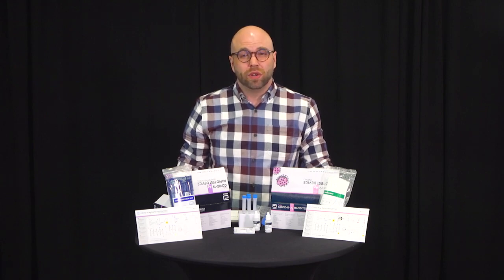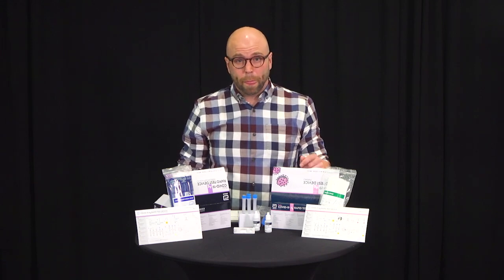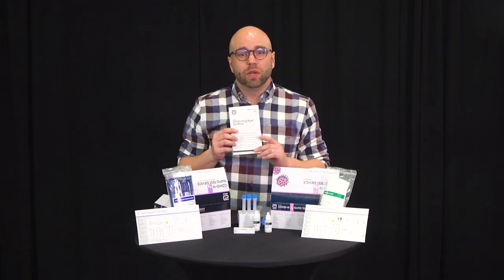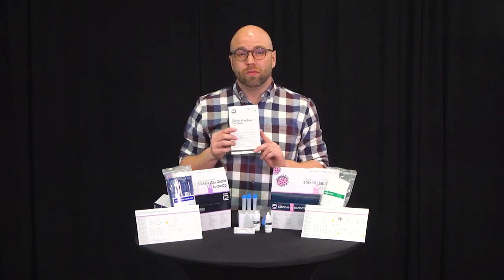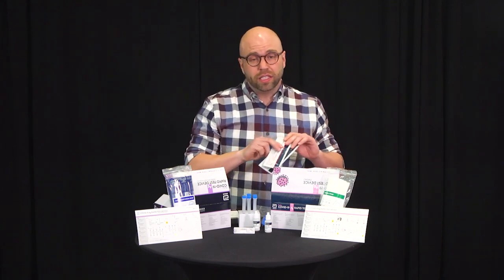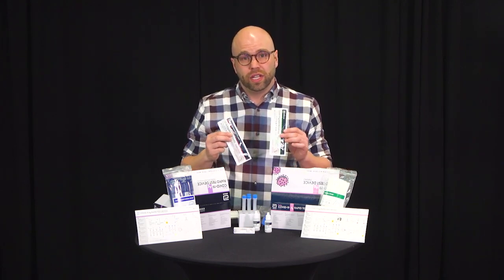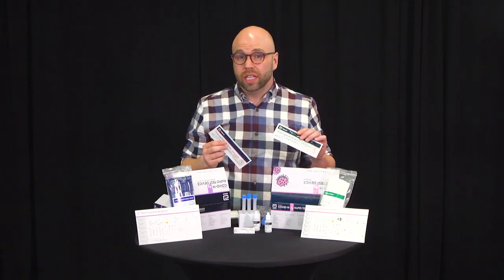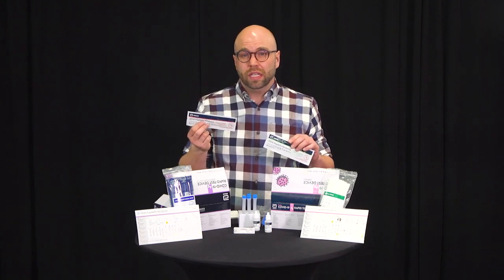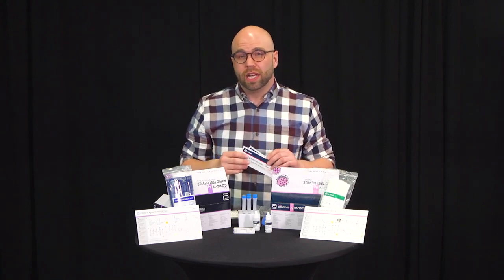The rapid test is a screening tool and not a full PCR test. When you receive your kit of 25, you'll also receive a manual. Please read the manual so that you know exactly what type of test you are performing. You'll also notice that there are two control swabs in the box. These are not to be used for any nasal collection. One will guarantee a negative result, the other will guarantee a positive result. They're only for quality control purposes and not to be used for any nasal swabbing.